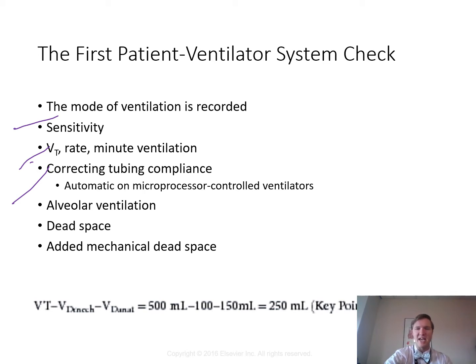The next one here is alveolar ventilation. Monitoring alveolar ventilation has declined in popularity. There's a lot of acute care facilities that don't include this on their flow sheet. So guess what? No one's following it. So therefore, if it's out of sight, it's out of mind, right? Unfortunately, it comes in very, very handy when you go to ARDS or low tidal volume strategies.